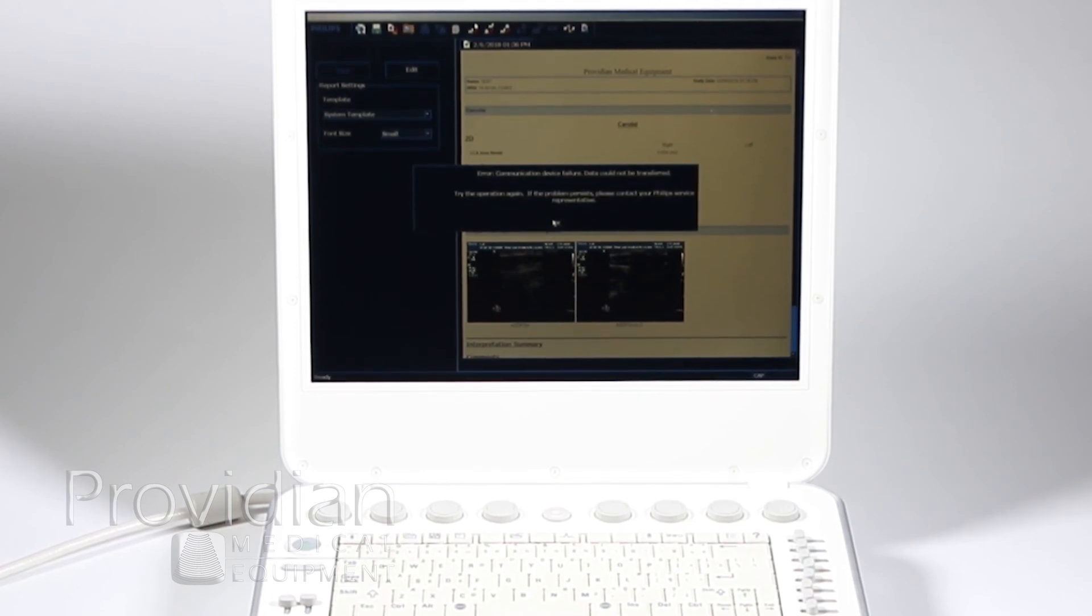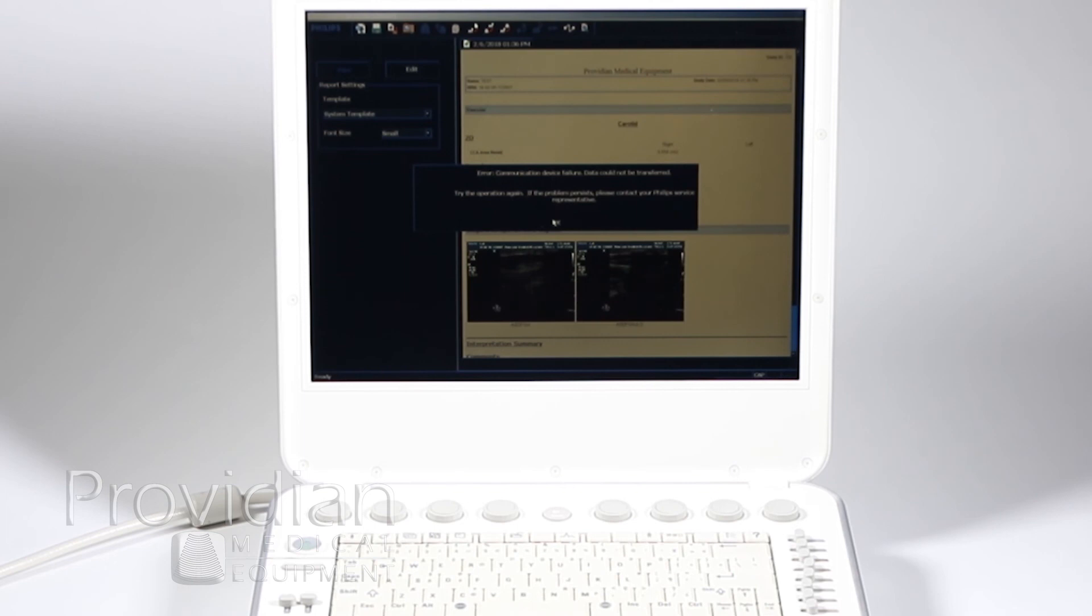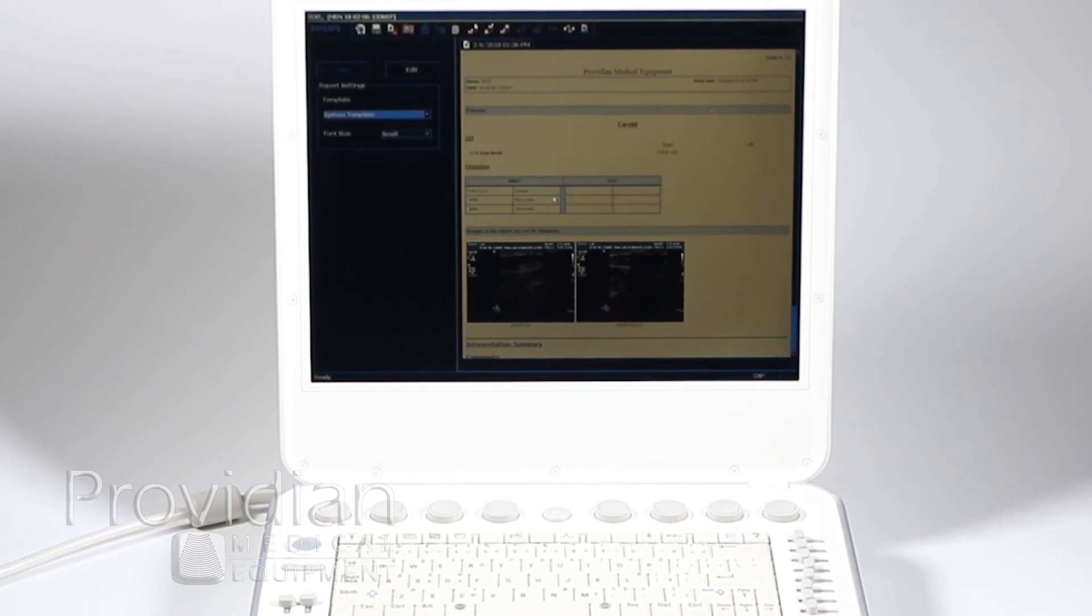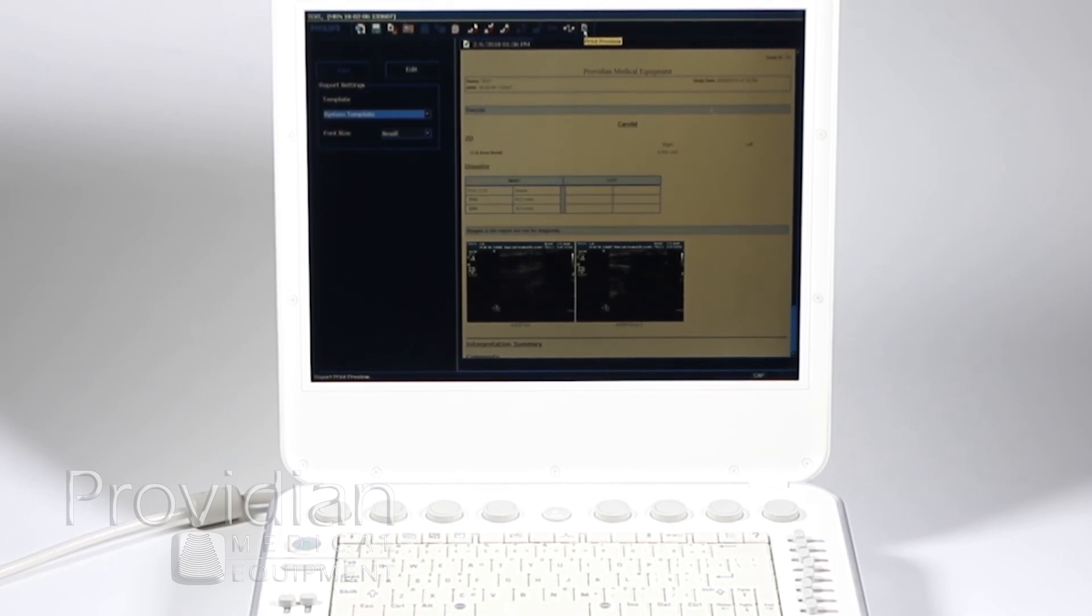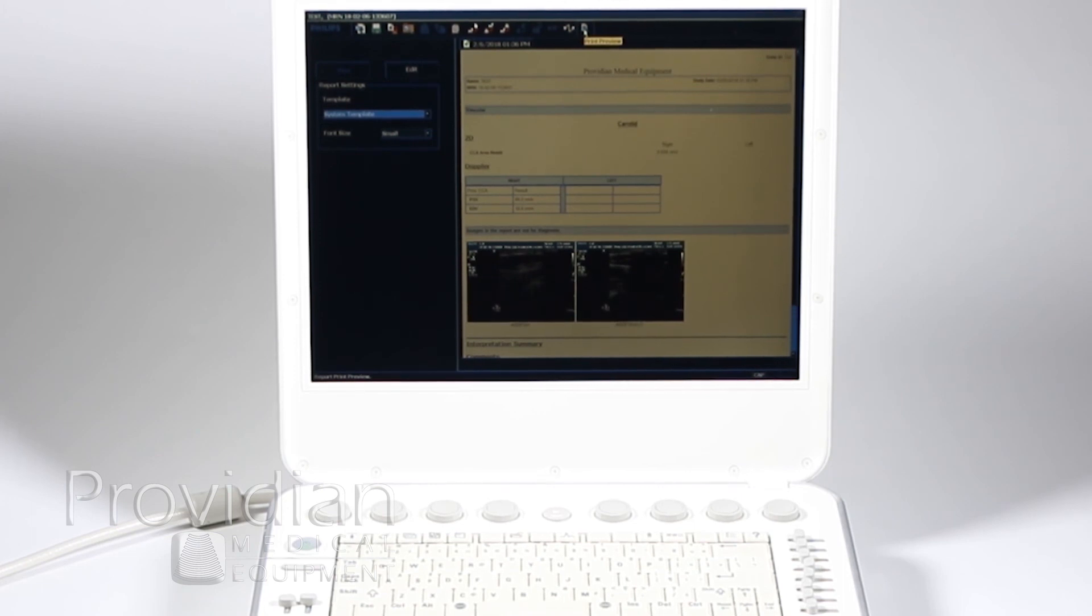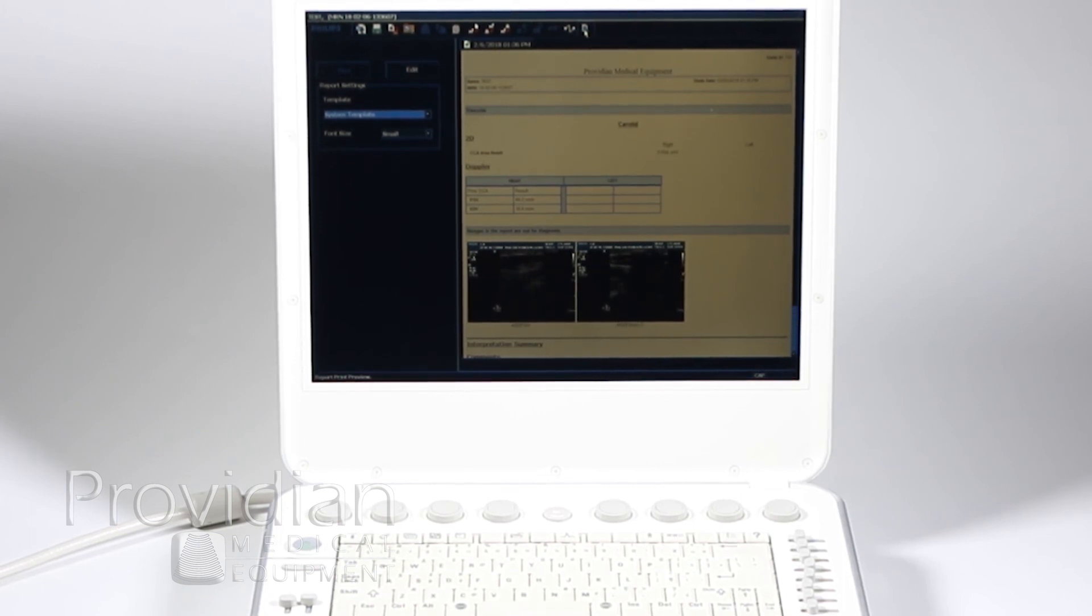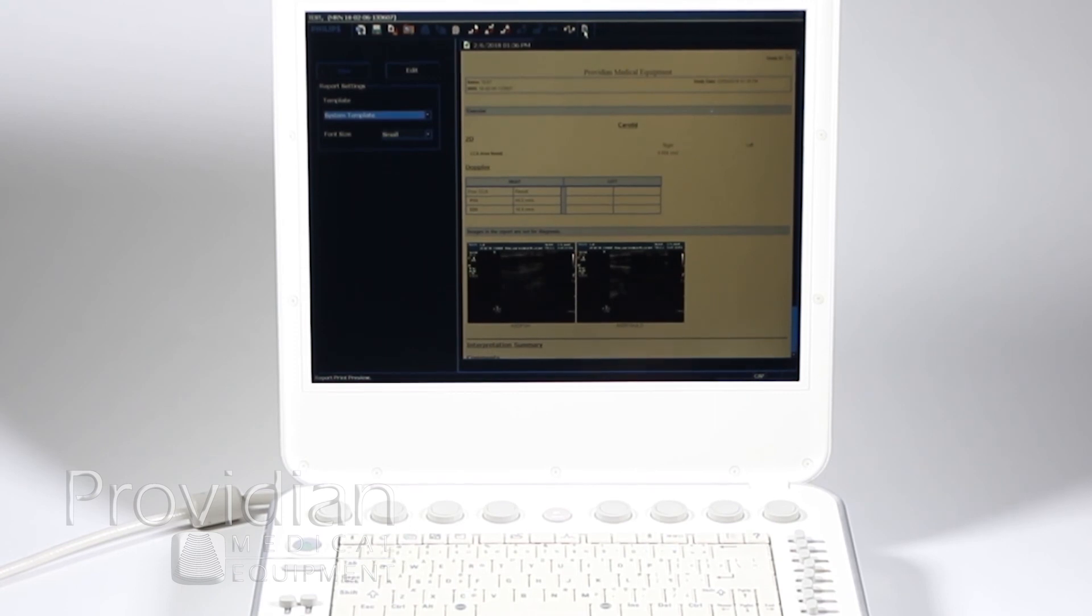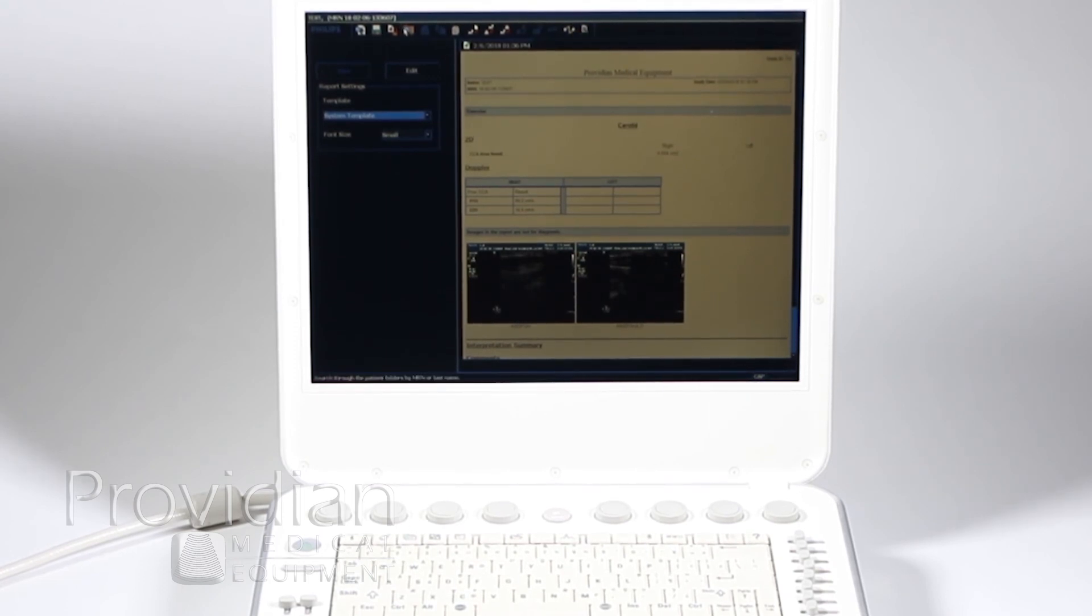But that's what you would click on to send the structured report over. But as we'll see later when I get to the export video, you'll see that you can export that structured report along with the images, so you don't have to do it twice. But if you want to be sure, you can go ahead and click that anyway.